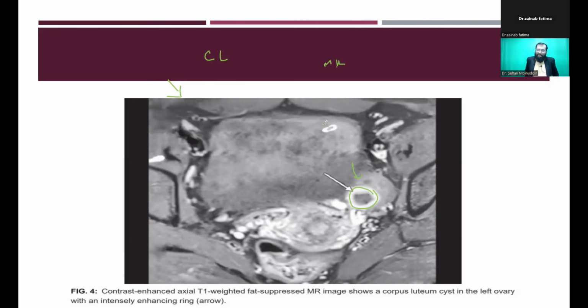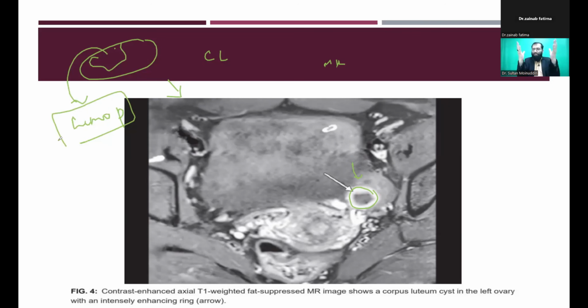Zainab, that's pretty easy. In ruptured ovarian ectopic, you need not even search for the corpus luteum. Why? Because as soon as the ovary ruptures, you would have lots of hemoperitoneum. The ovary is a highly vascular structure, so when an ovarian ectopic ruptures, it's dangerous. You will have lots of hemoperitoneum, and at that time, if UPT is positive and hemoperitoneum is there, you are very sure. You might sometimes see the ovary or sometimes not, just a little bit of hematoma or an adnexal mass.